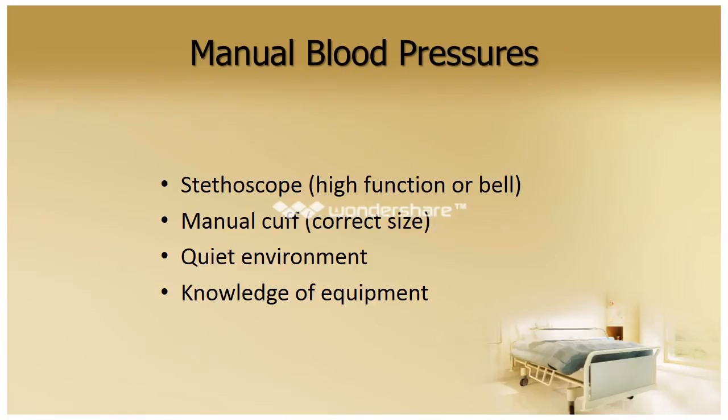You'll need a quiet environment. Excuse yourself from the patient and let them know that it's important to have quiet so that you can hear their pulse when you're obtaining the blood pressure. So turn down the radio or the television, or ask the visitors to keep the conversation level low so that you'll be able to concentrate and get information that's accurate. And then know how to manipulate your equipment. It's important to know how to use your blood pressure cuff, and it doesn't mean that you don't know. It just means that if we don't do it enough, sometimes we do lose it.